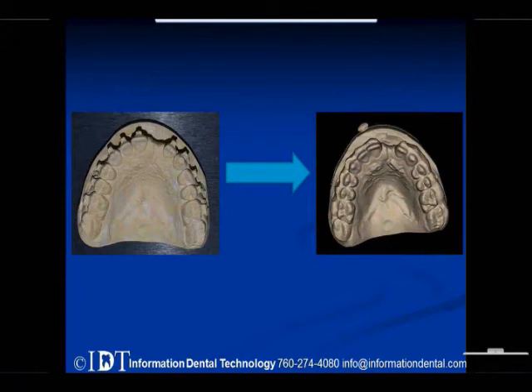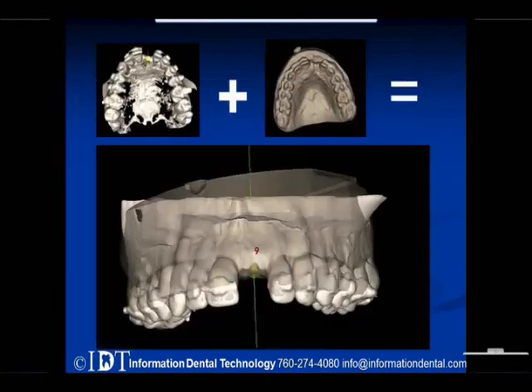And the reason I say that's a lot more accurate is because when you scan your model on your CT or CBCT machine, then that's subject to the Hounsfield unit threshold, as I was discussing earlier. And we can still get very accurate results. We've done that a lot. It's a quick and easy way to do it, especially if there's a lot of time constraints. It does take a few extra days for us to scan the model. But the STL, what that is, it's surface only. And what you scan, there's no threshold that it's on. So what you scan is exactly what you get in your computer. And so that's what makes it pretty accurate.